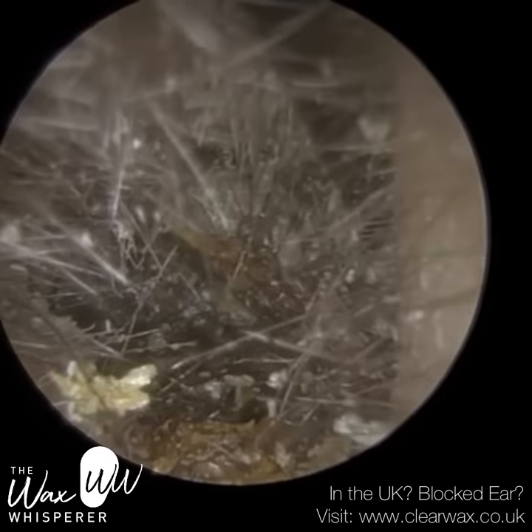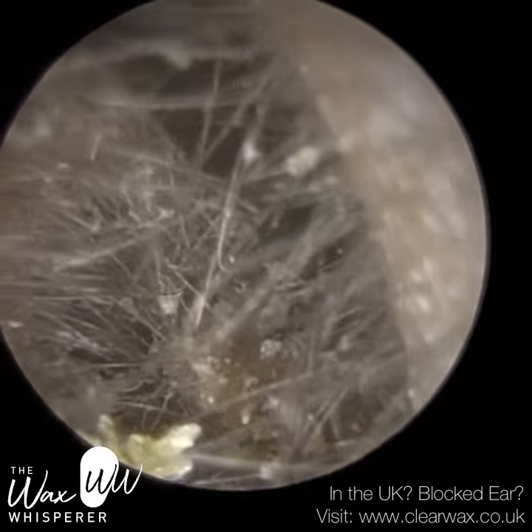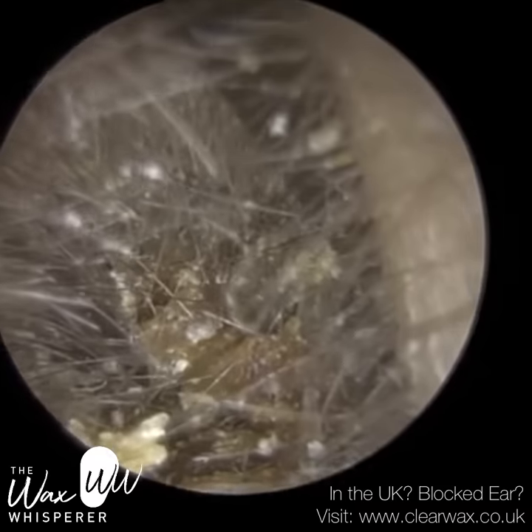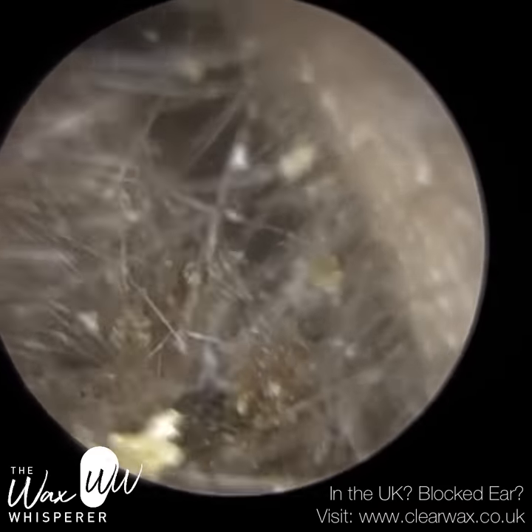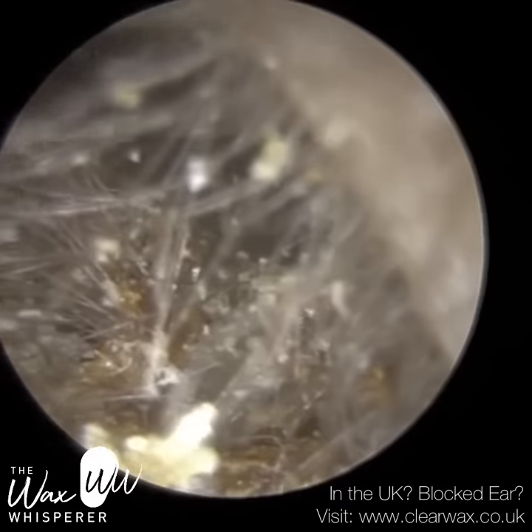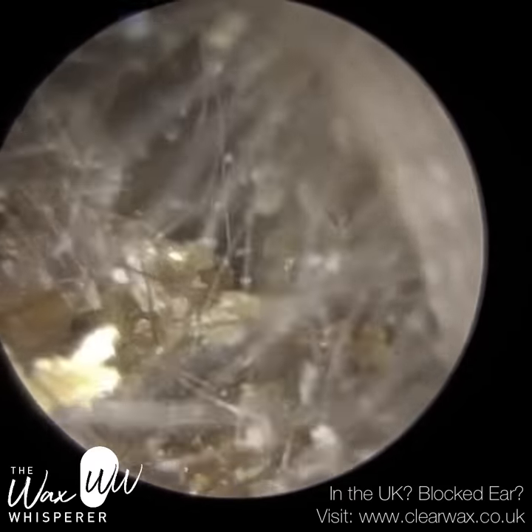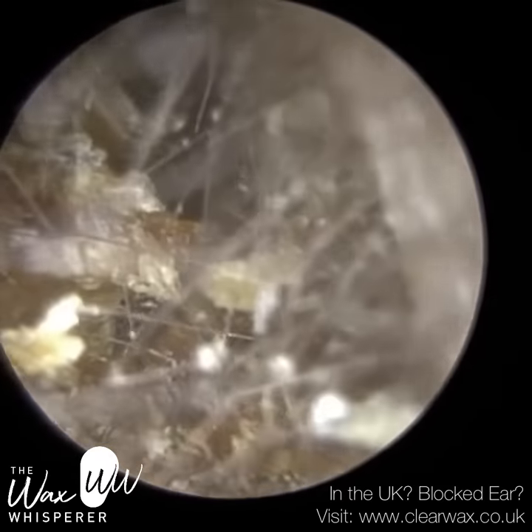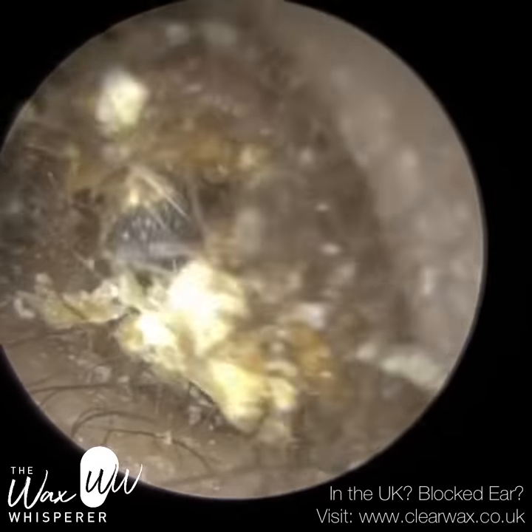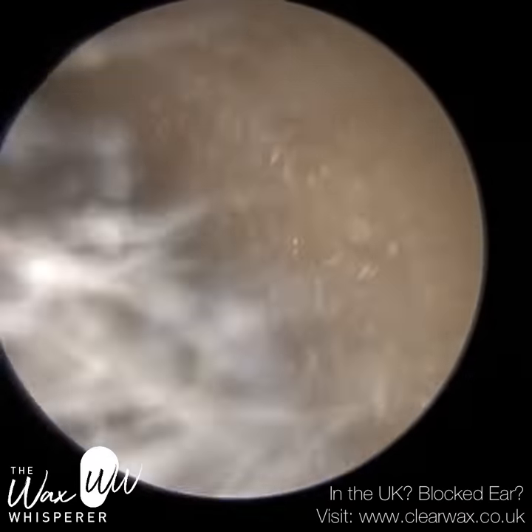I had to really chisel away, using the hook just to go to the posterior canal wall. This wax is strongly adhered to the ear canal because there's a lot of skin adhesions. The dead skin in the ear not only attaches itself to the surface of the ear canal, but it can envelope itself around the wax plug — it's almost trapping the wax in, it doesn't want to let go. So I'm just trying to separate and release the wax, elevate it off the canal walls, and once we've done that we can start bringing it away.